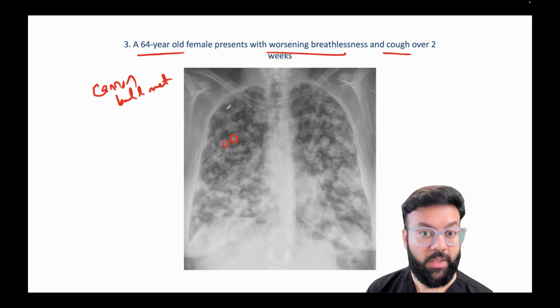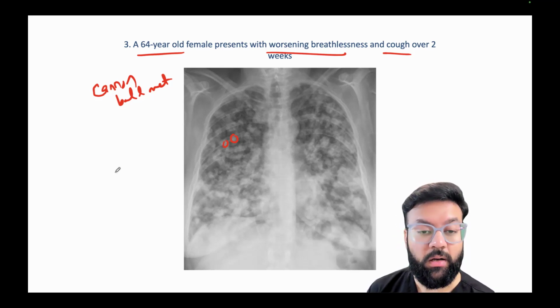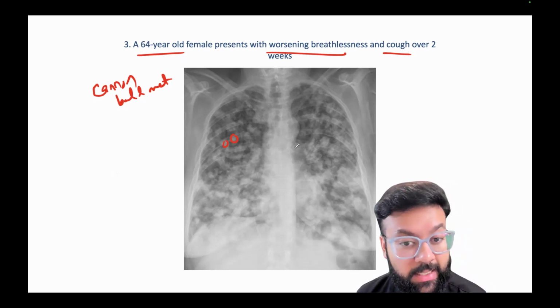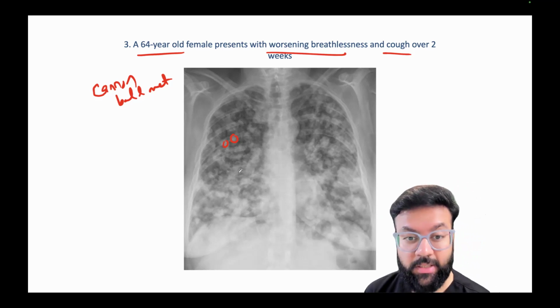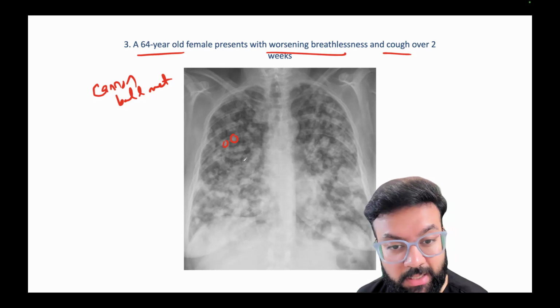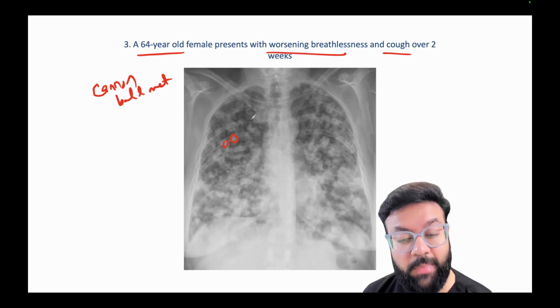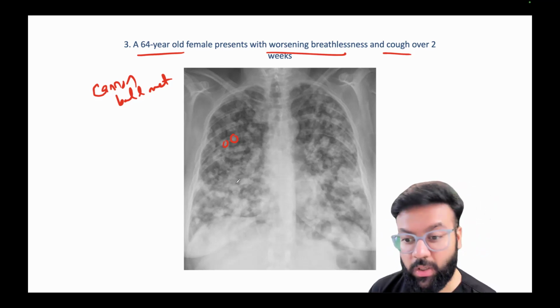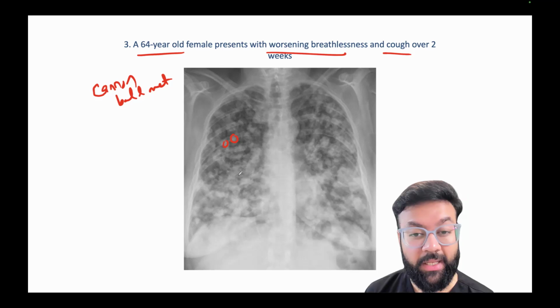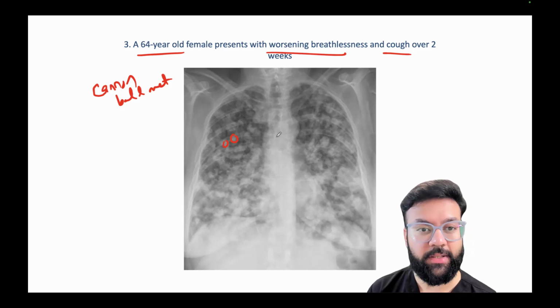Now this could be choriocarcinoma, which has metastasized to the lung. This could be some of the vasculitis like granulomatosis with polyangiitis. This could be any GI malignancy like adenocarcinoma or squamous cell carcinoma, which has metastasized to the lung, maybe sarcoma. Okay, so these are cannonball metastasis, and very rarely this may be an exaggerated response in tuberculosis. In tuberculosis, you classically see miliary TB, but if it's very, very severe, you might see a similar picture. Okay, so this is cannonball metastasis.